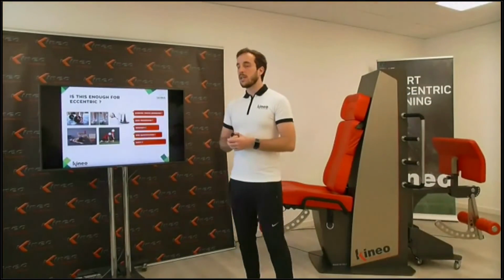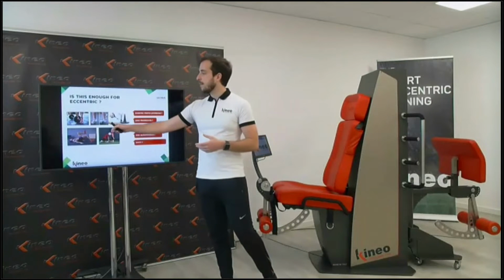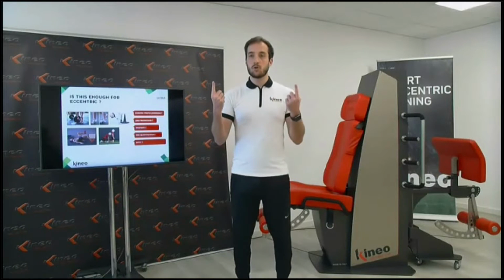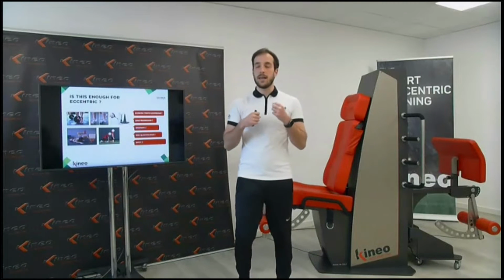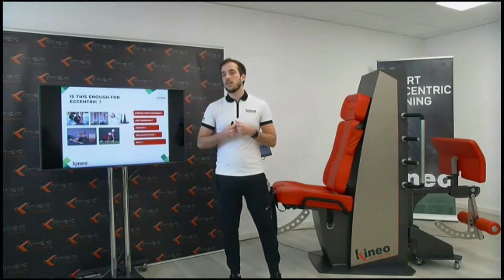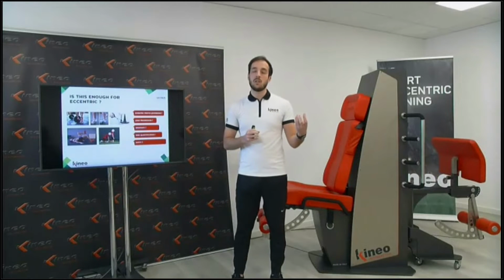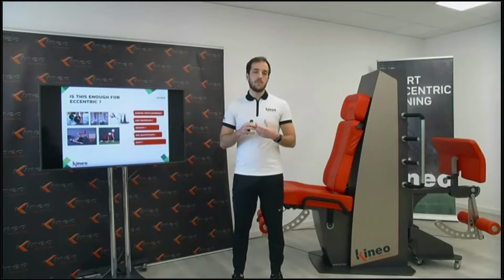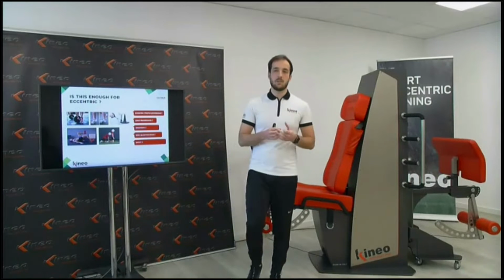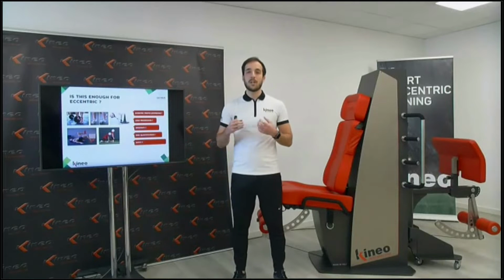So, for example, one other thing regarding this: if we take the calf raise exercise, where we ask our athlete to go up in concentric with 2 legs and go down with eccentric with 1 leg, I want to ask you these questions. Are we changing the internal load of that calf, of that gastrocnemius, or are we changing the external load of that gastrocnemius? If you ask yourself these questions, you will realize that, yes, of course, we are doing more eccentric on the leg that is taking the load of both, but as well, we're not giving any kind of proper eccentric overloading, for example.